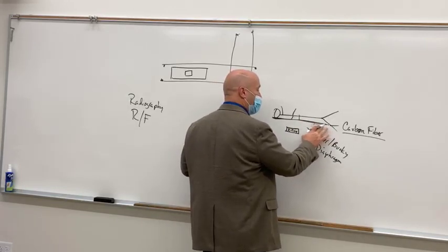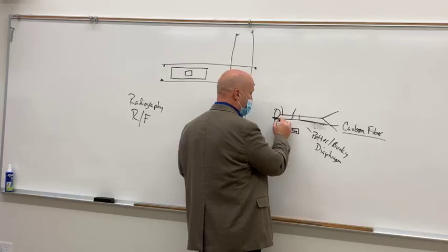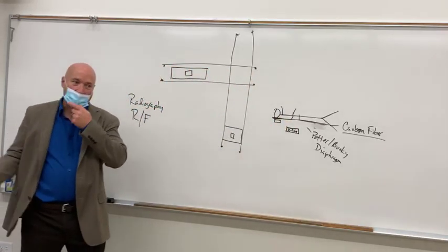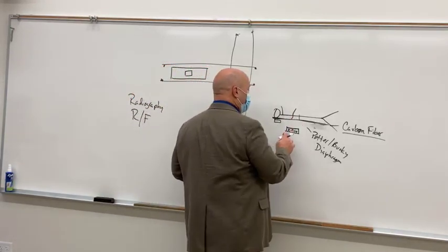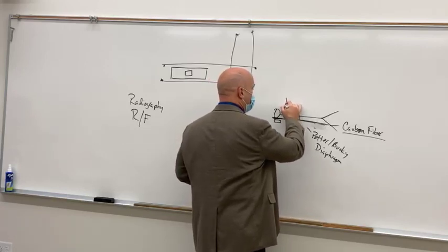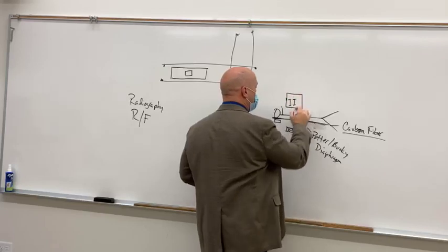But if we're doing a lumbar puncture, we might want to put it at the top of the table, depending on exactly how the patient's oriented on the table. It's got to get out of the way, right? So that's number one. Number two is that over the patient, you got this great big apparatus called the image intensifier. And that is your image receptor.